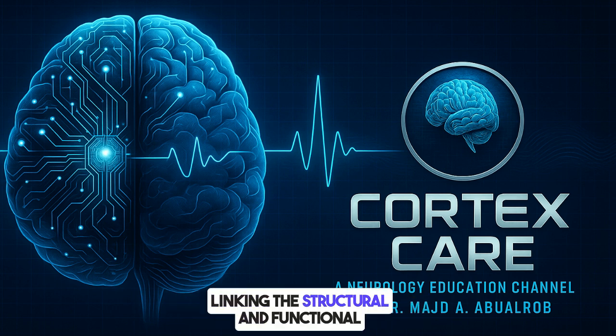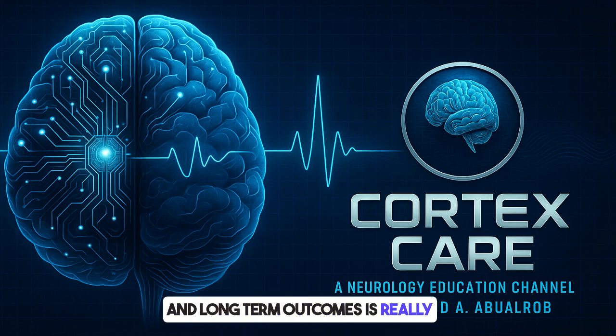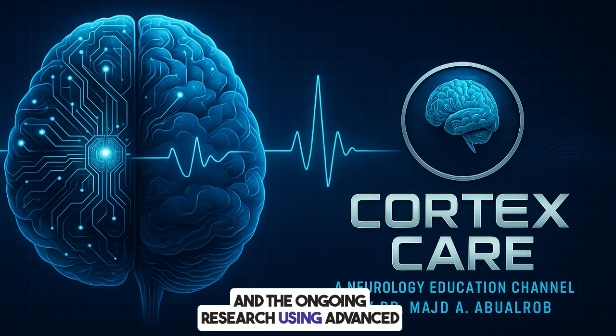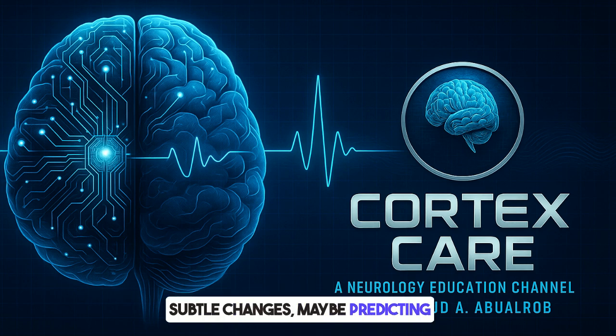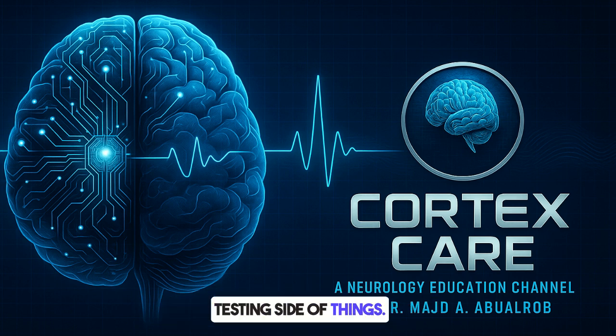Absolutely. Linking the structural and functional imaging findings to both acute symptoms and long-term outcomes is really pushing our understanding forward. It's really amazing, isn't it, how these different antibodies attacking specific brain targets can lead to such varied pictures on an MRI scan? It truly is. And the ongoing research using advanced MRI techniques, things like DTI to look at white matter tracts or quantitative mapping for tissue properties, holds huge promise. Promise for what? For potentially detecting even more subtle changes, maybe predicting severity or outcomes better, and really complementing the immunological testing side of things.